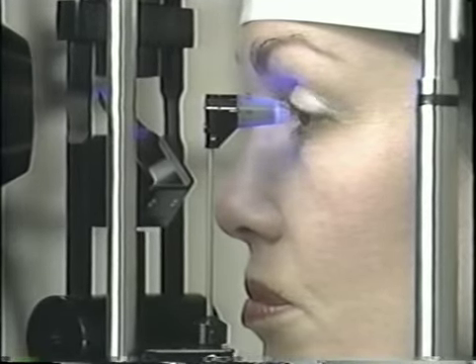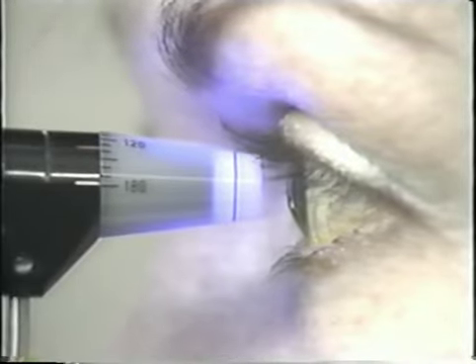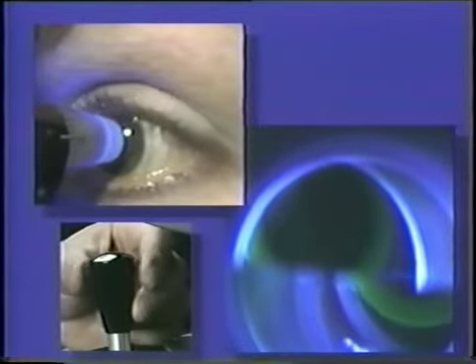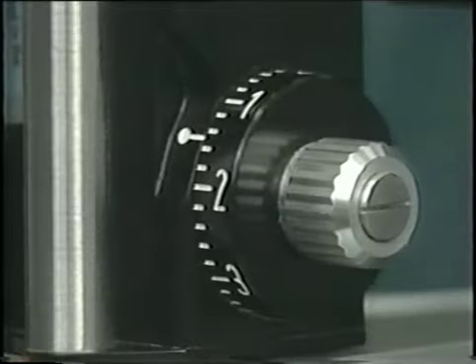The initial position should be slightly inferior to the visual axis to slip under the eyelashes of the upper lid without touching them. The tonometer is then raised until the prism is centered on the cornea and gently brought forward with the joystick of the slit lamp. The slit lamp should be adjusted up or down to get 2 exact semicircles. Once the tip is properly aligned and positioned, the applanating force on the cornea is varied by turning the dial until the inner borders of the fluorescent mires barely touch. Intraocular pressure is then read from the scale on the tonometer housing.